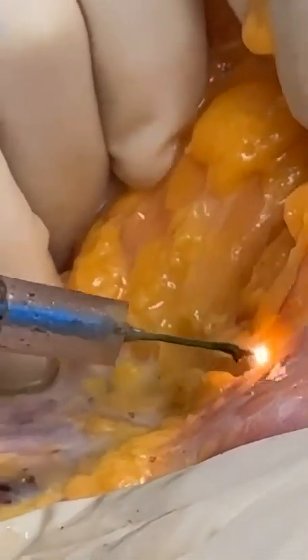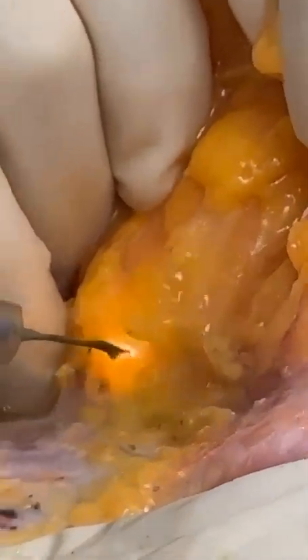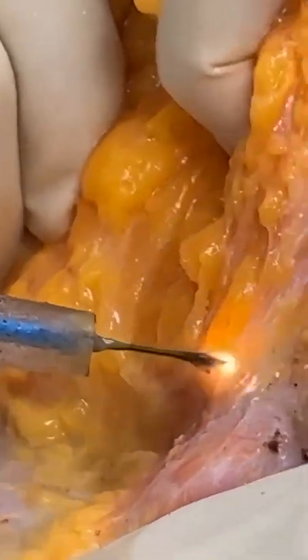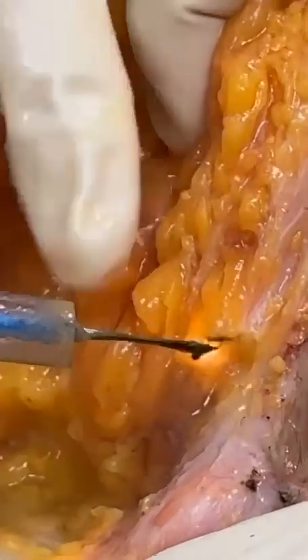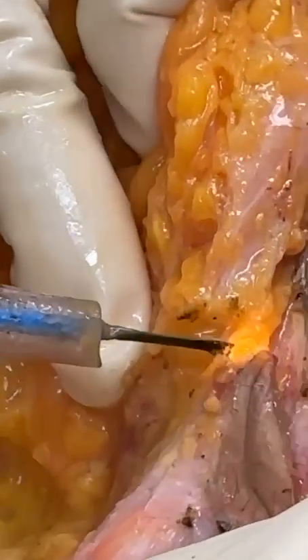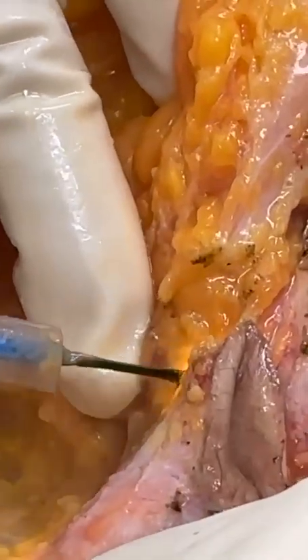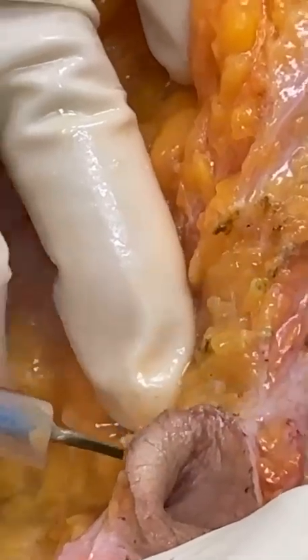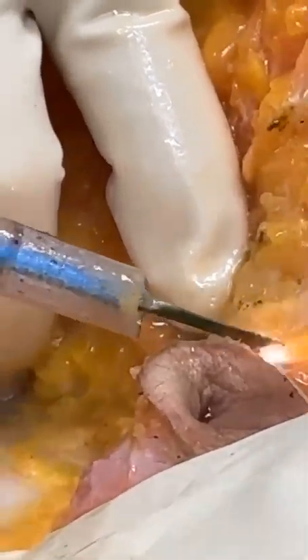And that's your belly button that we have healed, and we leave it like a bonsai, right? Like a little mushroom, actually. See, I'm going right around that belly button over here. See, right here where my finger is. That's the belly button. We're healing it like a little mushroom. Incredible. See how it's coming out? Beautiful.